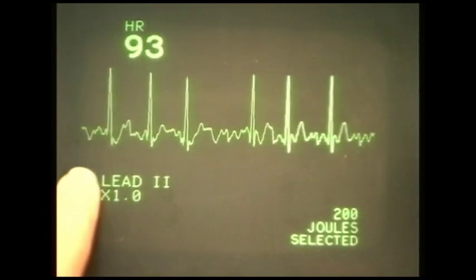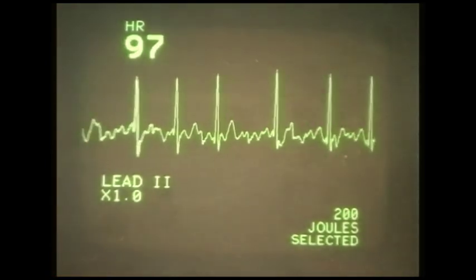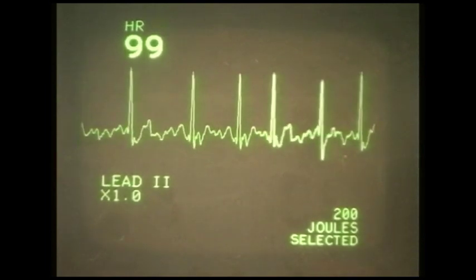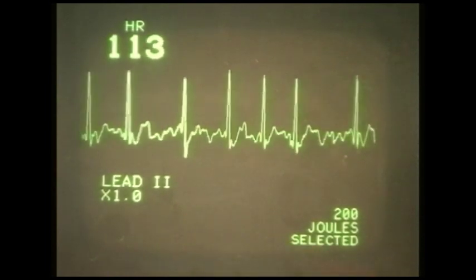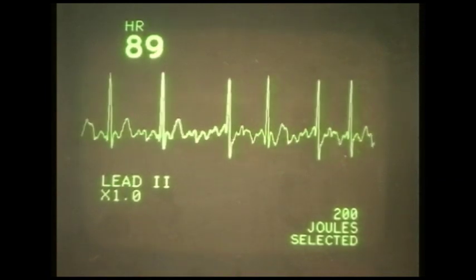And what does this lead 2 signify? So that's the lead, the position that we're actually looking at the rhythm from. We have, so this is limb lead 2. And this is the amplitude that we're actually, or the gain that we're looking at underneath.